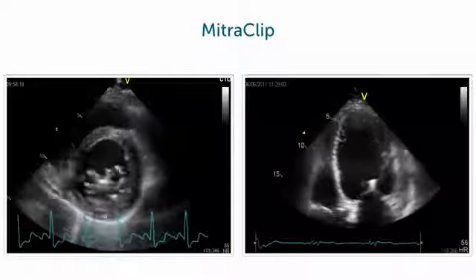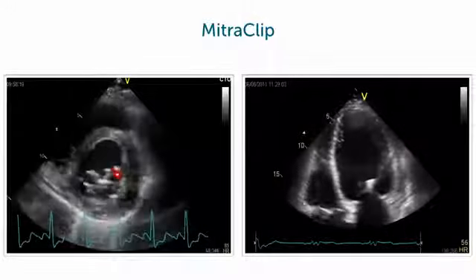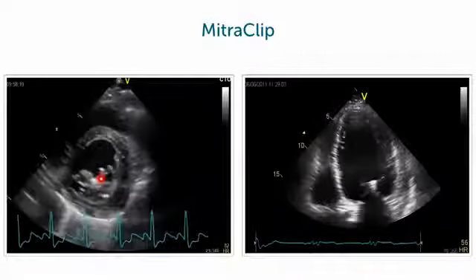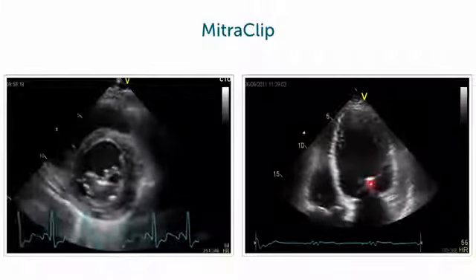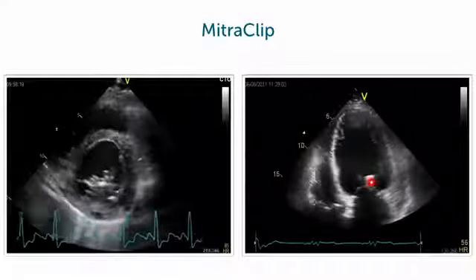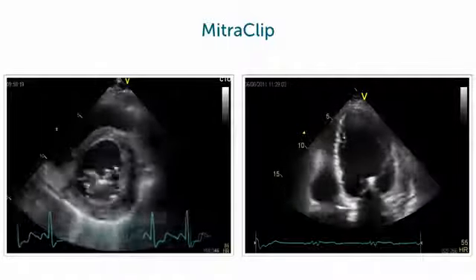What is the mitral clip? It's a special clip that we implant into patients who have severe mitral regurgitation and who are no surgical candidates. In this case, we cinch together the anterior and the posterior leaflet and create kind of a double orifice. You see right here and here is the second orifice, right here. And in between we have this echogenic clip. It's a metallic clip and therefore you also have artifacts. When you look at these clips in a 4-chamber view, you have the impression as if the mitral valve is not opening at all, at least not in the region where the clip is. So another foreign body that you might be able to visualize on echocardiography.